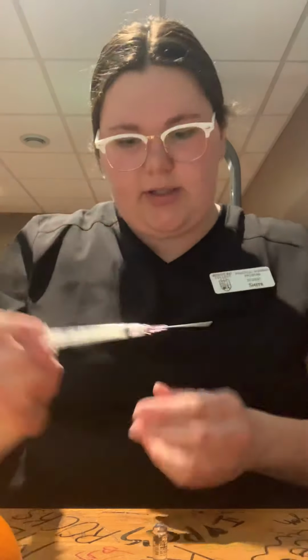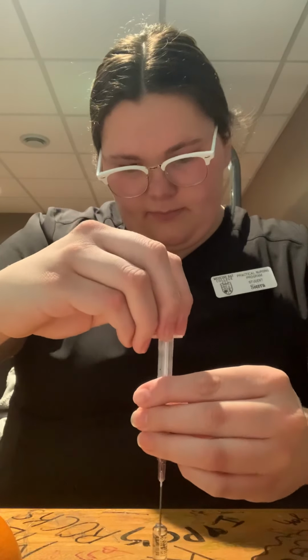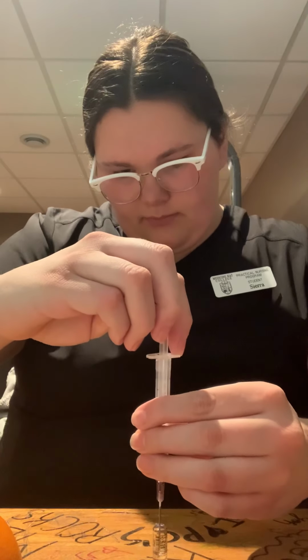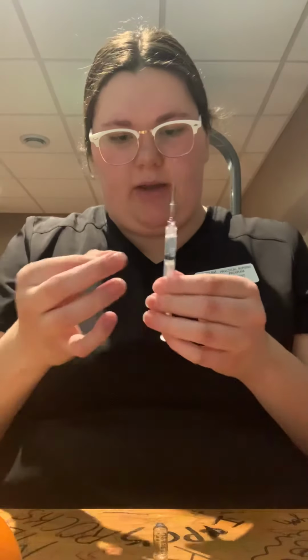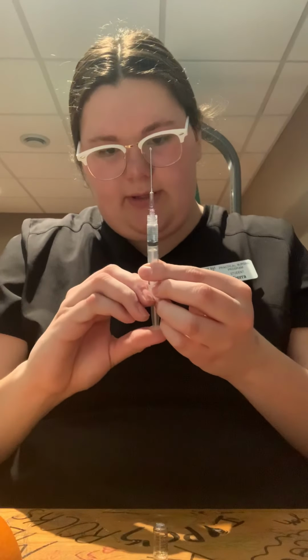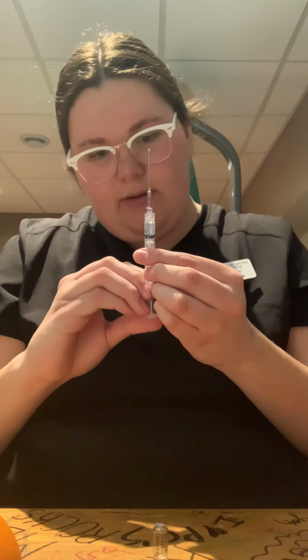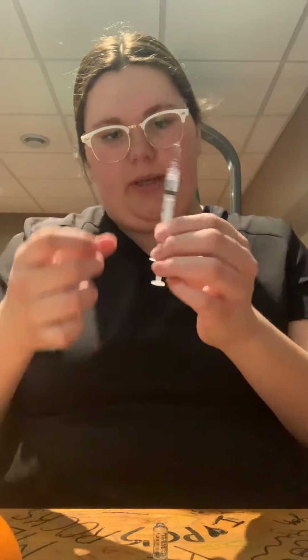Oh, and our plunger's a little stuck, so I'm going to unstick it quick. There we go. Now, I went a little over, that's okay. We're gonna get our air bubbles out, and then we're gonna squeeze till we have 0.5 of our liquid. It's okay if a little comes out. So there we have 0.5.